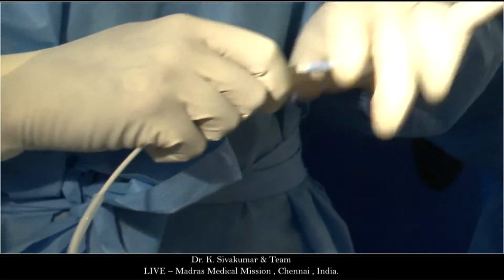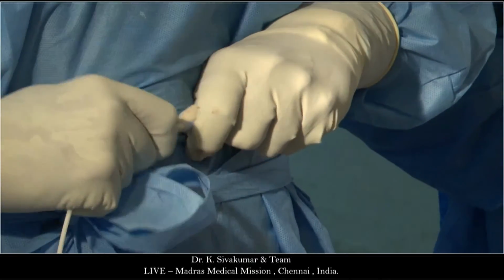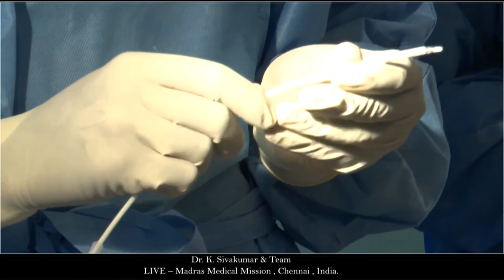I'm finding it a little tough to push it through a 12 sheath. It's very tight.